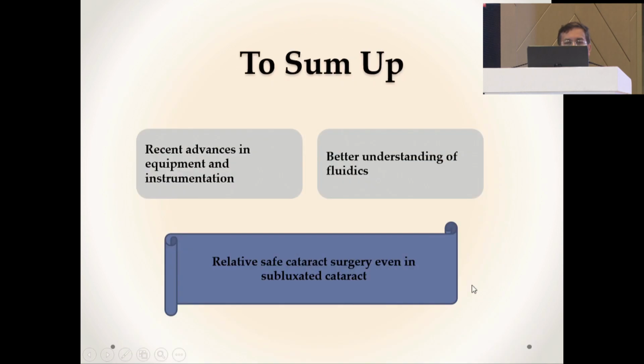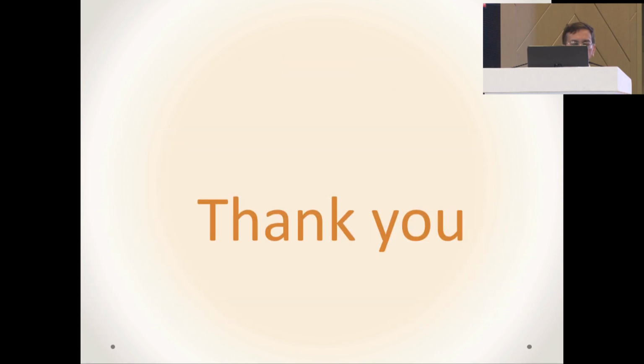So in short, recent advanced equipment gives a better understanding of fluidics and relatively safe cataract surgery even in subluxated cataract. Thank you friends.